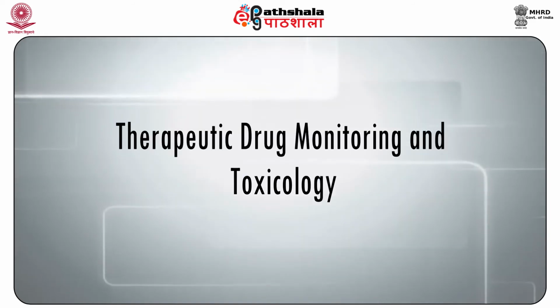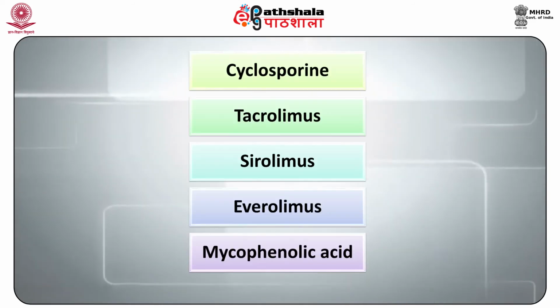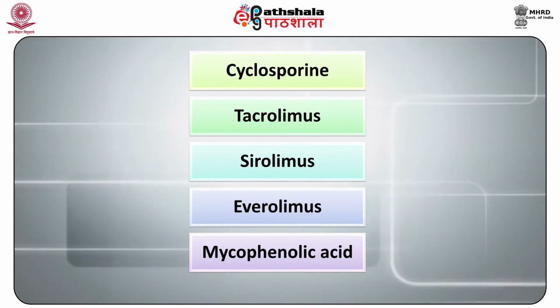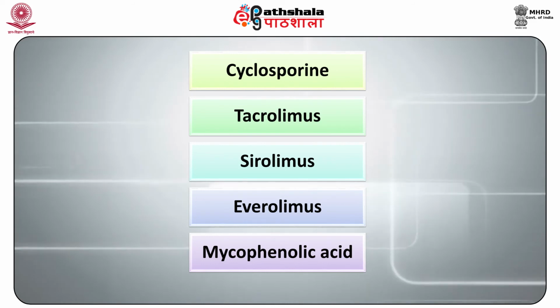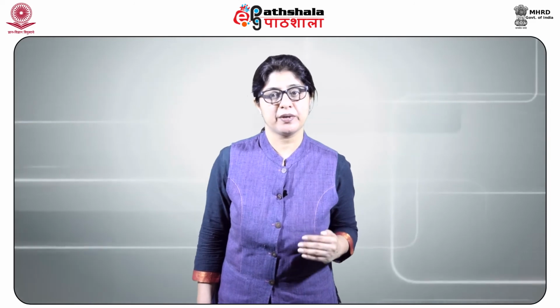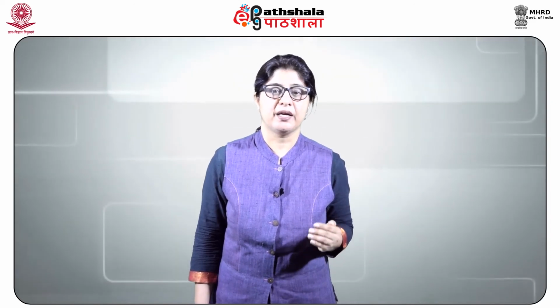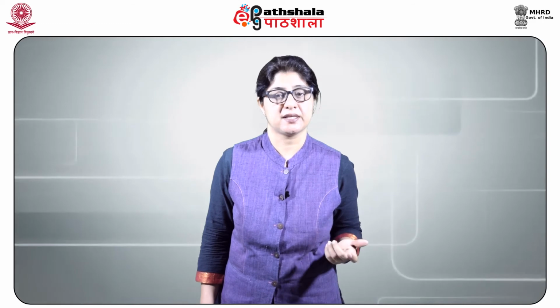Therapeutic drug monitoring and toxicology. Assays have been developed for immune suppressants such as cyclosporine, tacrolimus, sirolimus, everolimus and mycophenolic acid. Measurements of steroid hormones. Difficulties with the measurement of the low testosterone and dihydrotestosterone levels found in women and children using conventional immunoassays have prompted the development of several highly sensitive LC-MS assays capable of providing reliable measurements in these groups.